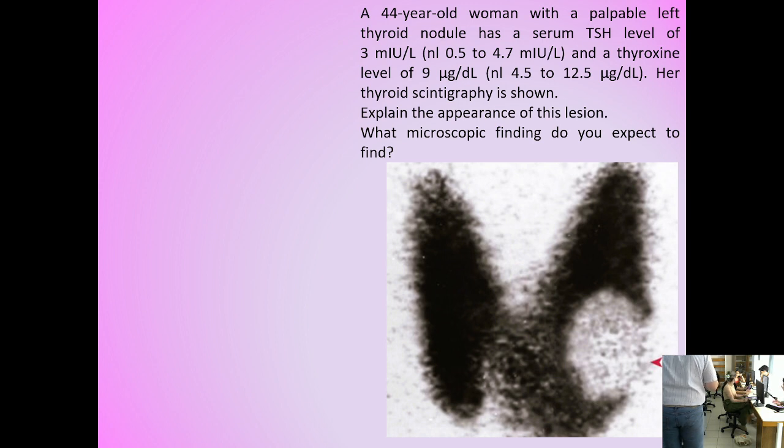Here in the lab? No, we just see tissues, but we must know all this situation, all this data, so as to describe our tissues correctly. This is important clinical and radiological information that we take into account when we take sections from a thyroid lesion, because first of all, we must relate what we see microscopically within the gland with this.